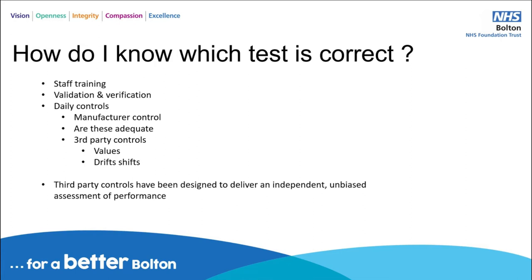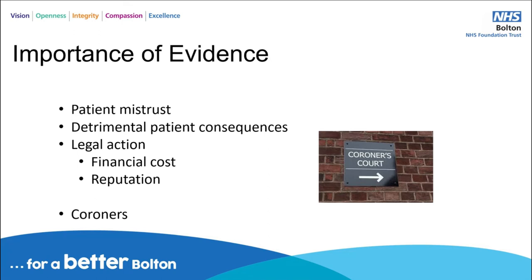And one important thing to say is that third party controls are designed to deliver an independent, unbiased assessment of performance. So we can say, yes, we know that the controls we have in place are not controls that we have made or decided upon, but were made to validate the work that we are doing in the lab. And it is important evidence of the tests and the standards of tests that we do.